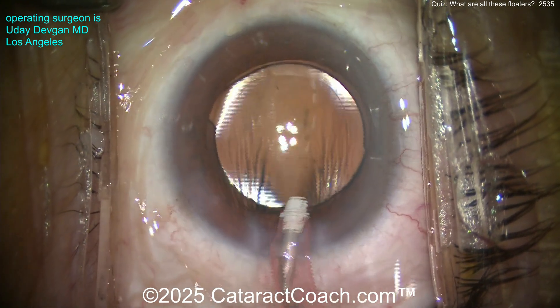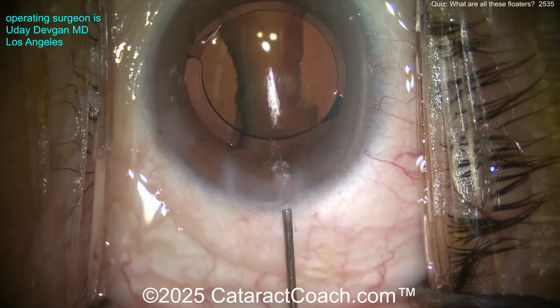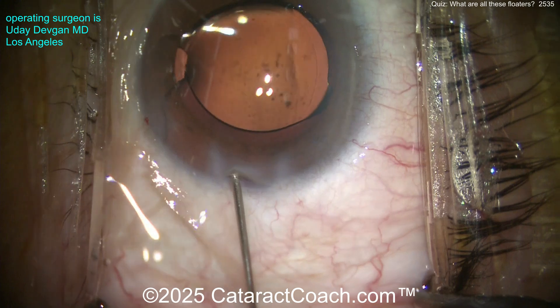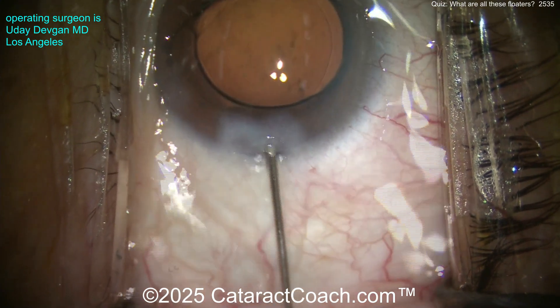This is just a patient with age — some zonulopathy that happens to some people. I don't even see any pseudoexfoliation here, which is good for the patient. But at the end, look back there in the anterior hyaloid space — Berger's space — we've got a little bit of lens material.